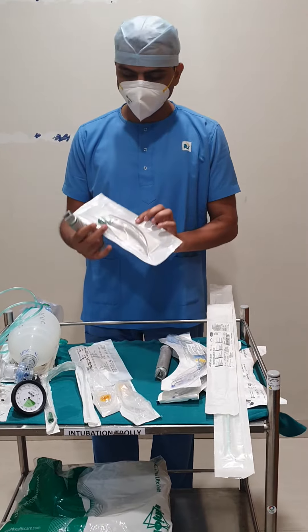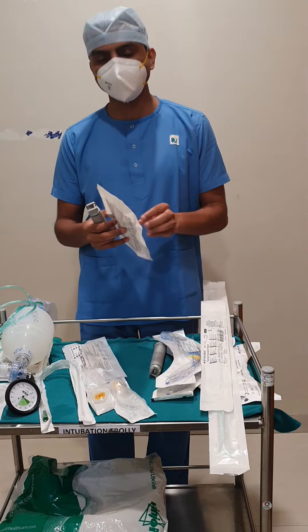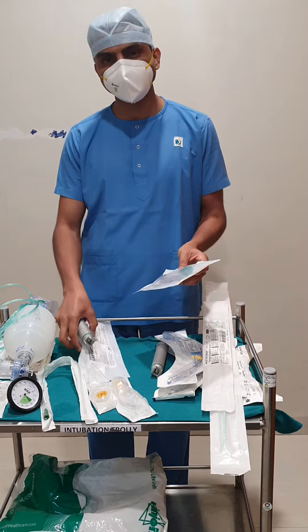This is the laryngoscope and the different sizes of blade. Usually, we use size three and four blades for the adult patient, and one and two for the pediatric patient.